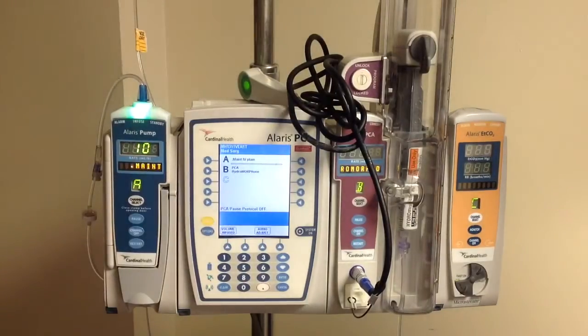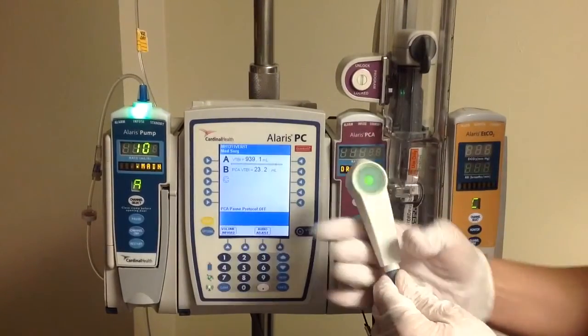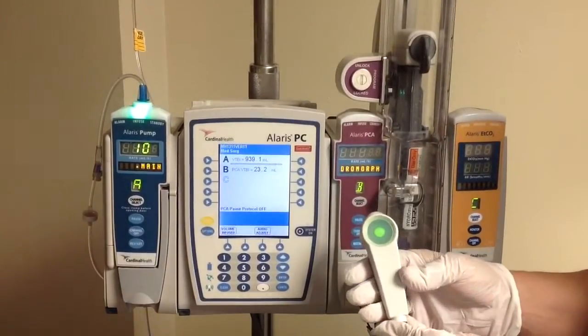After completing programming of our PCA pump, we're now going to turn our attention to educating the patient regarding the dose request cord. As you can see here, the light is green on our dose request cord, and that means that the patient has a dose available.